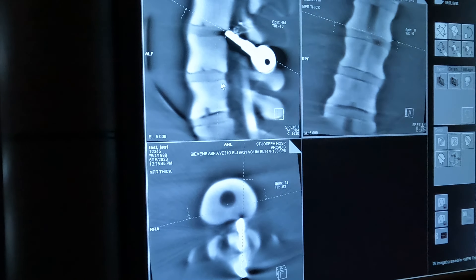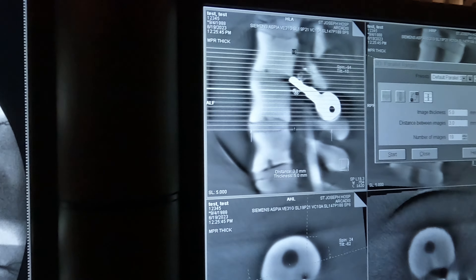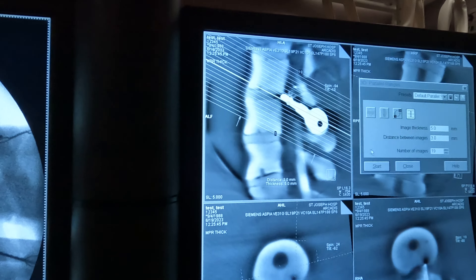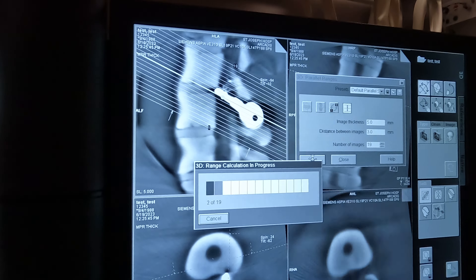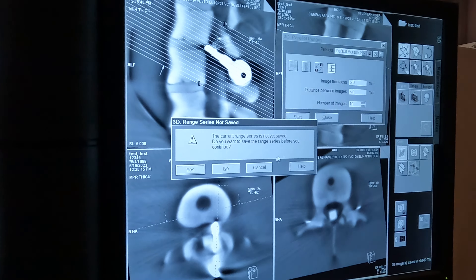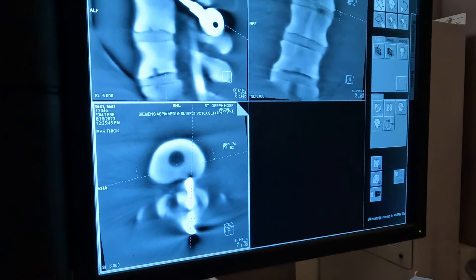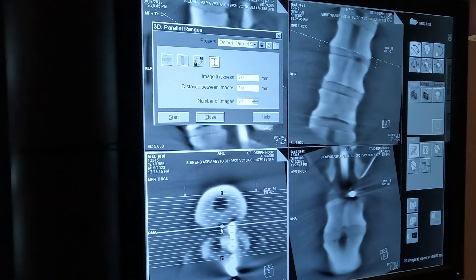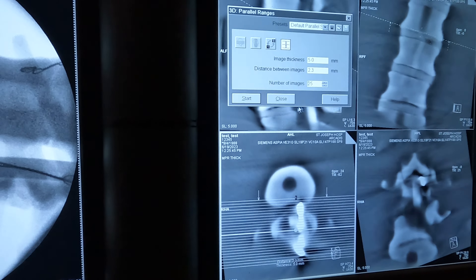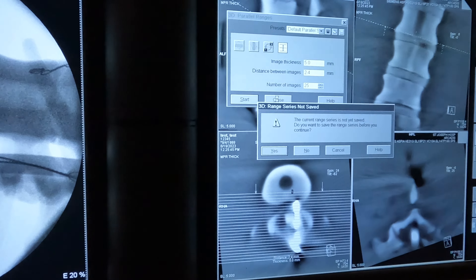That was for the first one — you'll need to make one for all three. Click here, put this in a good spot, and use this to match the key. Press start, you'll see it flash, it looks good, press start again and say yes. Close that and say no — you don't need to save it twice. Do the same thing for the third one: parallel lines, move it down, add a couple of lines, press start, it looks good, press close and yes.